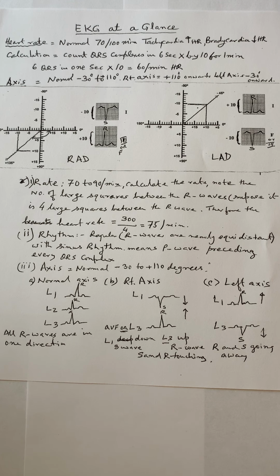and put a horizontal line from the minus side, from R, S is 10 millimeters deep, and R is plus. So R is plus, on the horizontal line. Supposing plus is 10, so on the horizontal line, you put a dot on the right side, plus 10.